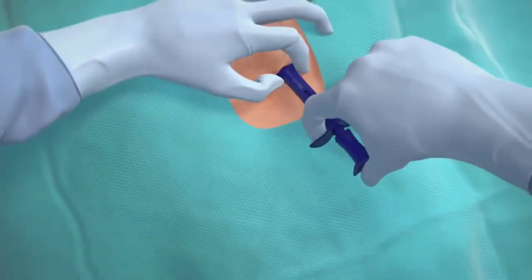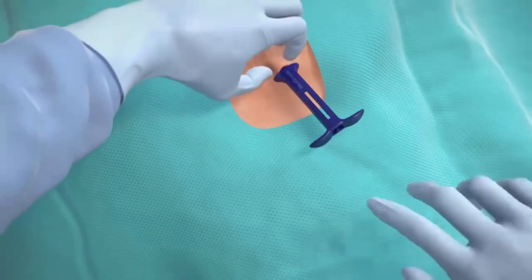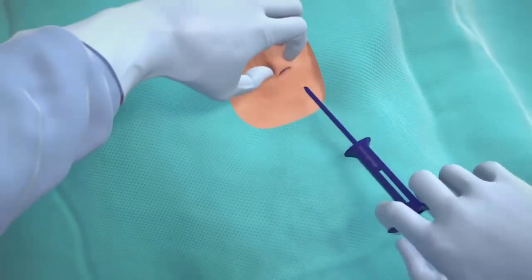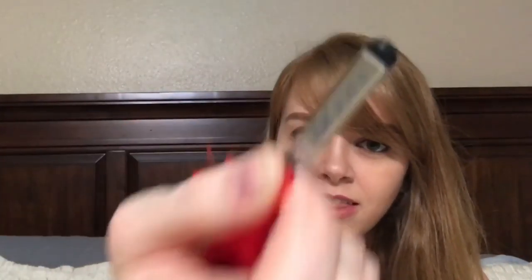Implantation was super easy — I think it's something they could probably do in a doctor's office. You don't need sedation. It took longer to do the sterile prep than it did to actually implant it. I was awake the whole time and didn't feel anything aside from the initial lidocaine poke, and after that it was just glue — healed in a couple days and I never noticed it after that. They took it out when they put my pacemaker in. I just wanted to give some information about this cool device, and now it's a Christmas tree ornament.